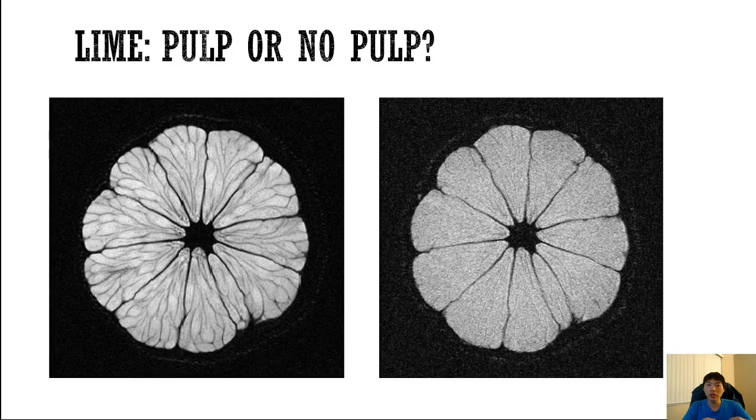By changing certain parameters on the MRI scanner, we can effectively acquire different looking images. And this is very useful because different kinds of cancers, different kinds of tumors have different properties. By tailoring our imaging to a particular type of cancer, we can get better, more detailed images specifically for that anatomy.